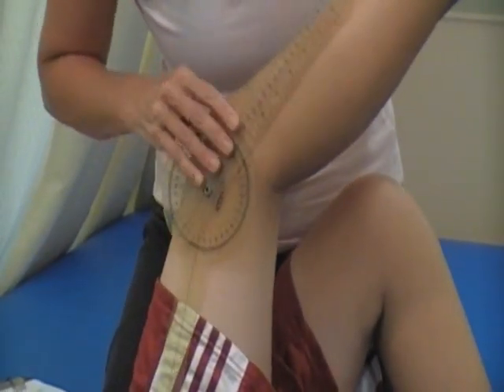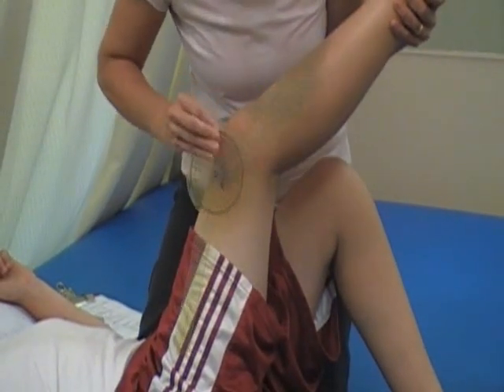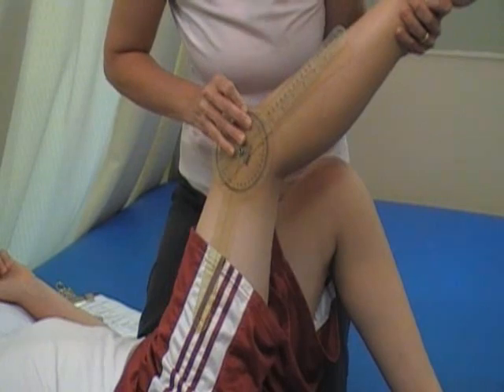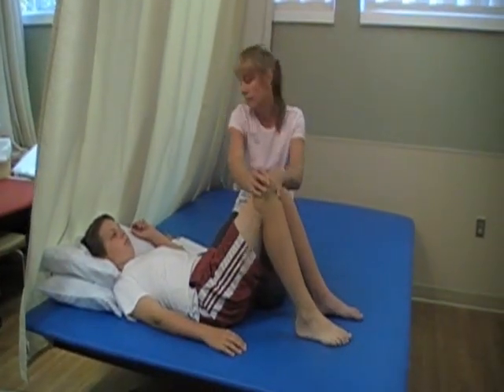And again, it's really helpful if you have another person. It makes it go a lot faster. And they can actually help you with all of your alignments. You want to look at that on both legs.